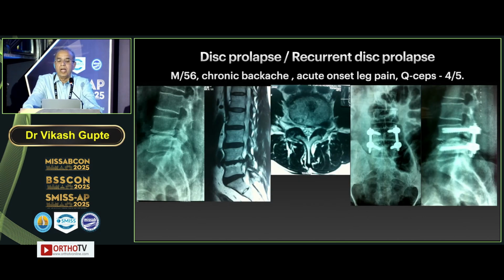What about disc prolapse, recurrent disc prolapse? Now here is a case of extraforaminal disc prolapse. Normally I would do PELD or endoscopic surgery for extraforaminal disc, but here if you analyze the case, there is a disc degeneration with irregularity of the end plate, hence I opted for MIS-TLIF.